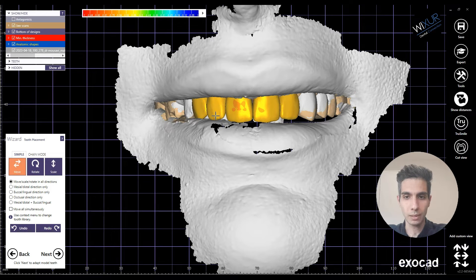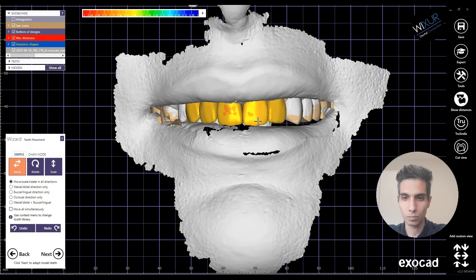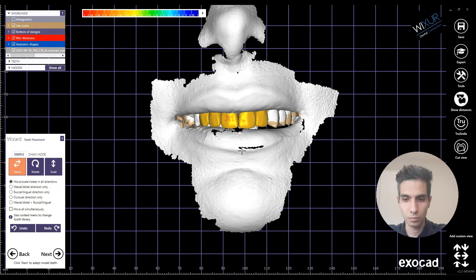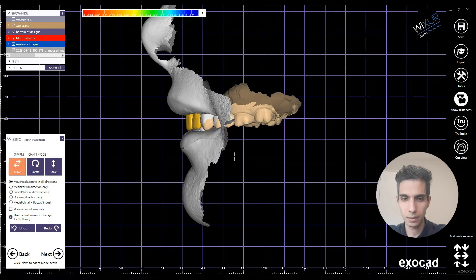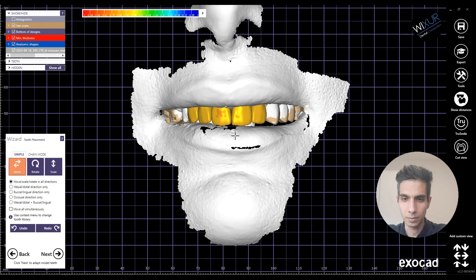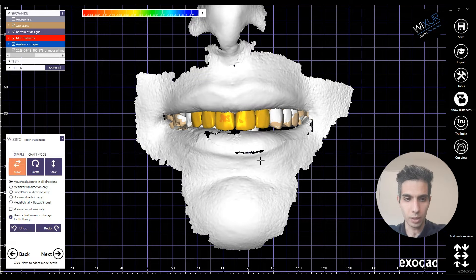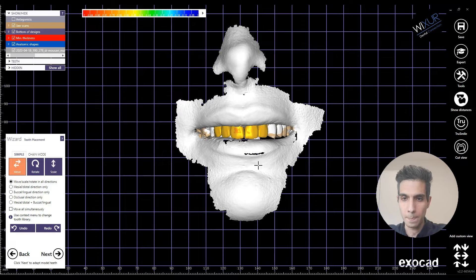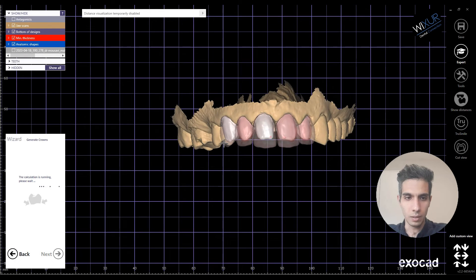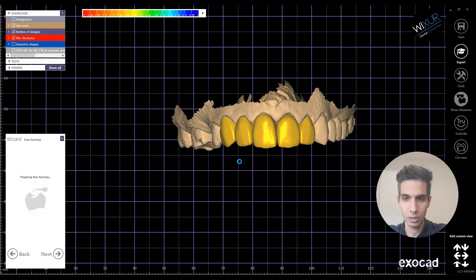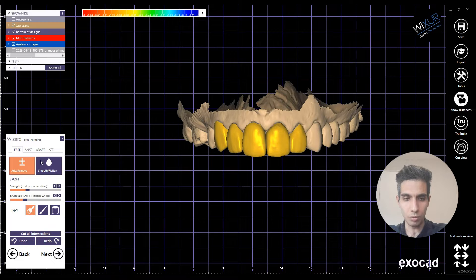So with this face scan, I can now continue the design using it and finish the tooth placement. Yes, that's a good one. It's also a good guide for the midline — I can adjust it with the face scan. Let's go further, and now in the free forming tab let's do the final adjustments.